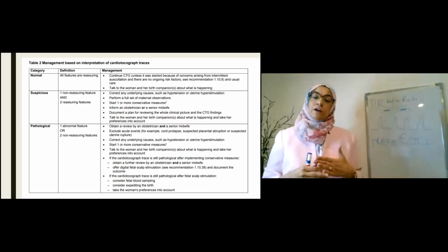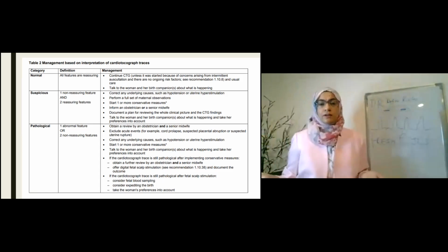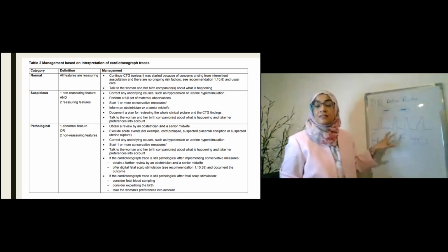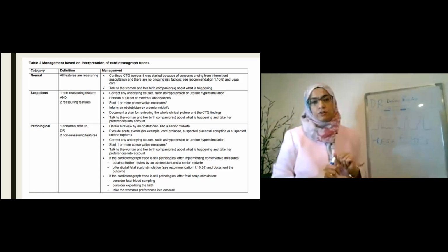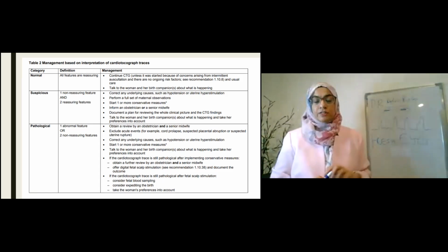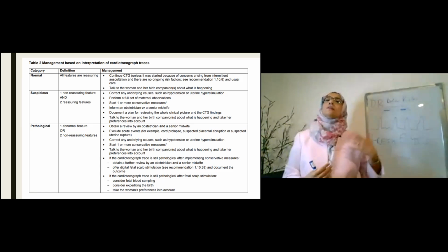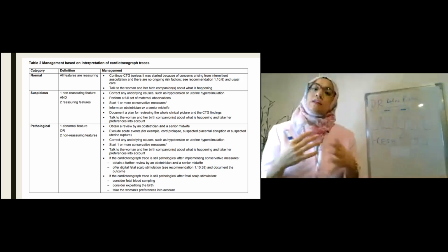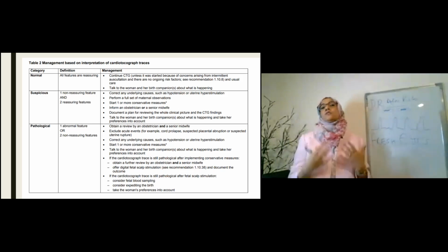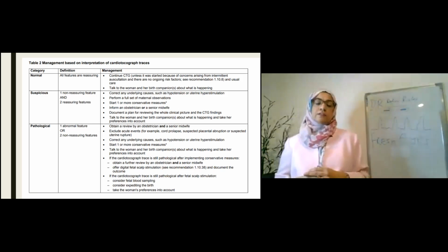Every 3 to 4 hours, somebody else from some other room, maybe whose patient has delivered now, will come and put the fresh eyes sticker on the CTG, look at it and say, fresh eyes done. Yes, you're right, it is a normal CTG. Let's carry on. And these decelerations have non-concerning characteristics. You shouldn't worry about it. Let's give this lady a chance to labor. So this is how we get rid of inter-observer differences so that we don't risk a baby because of human factors. Because we have to talk about the human factor in all this interpretation that we are talking about.